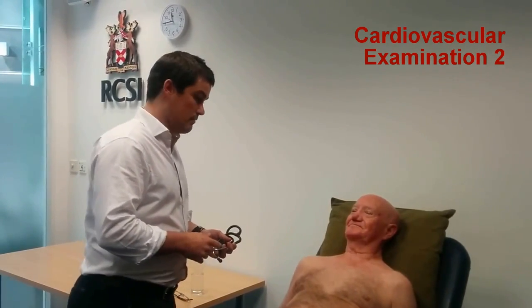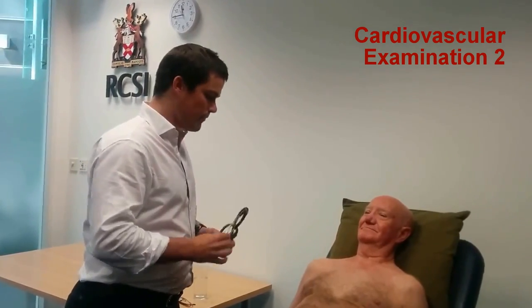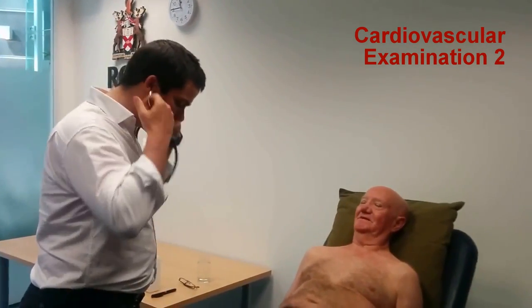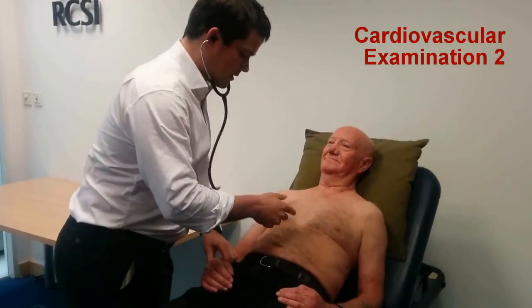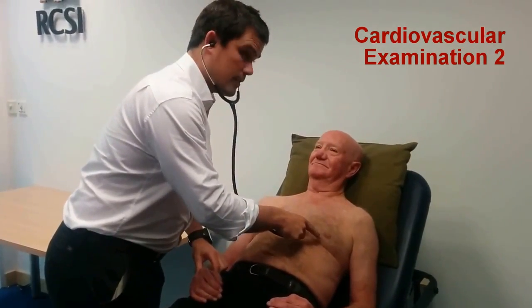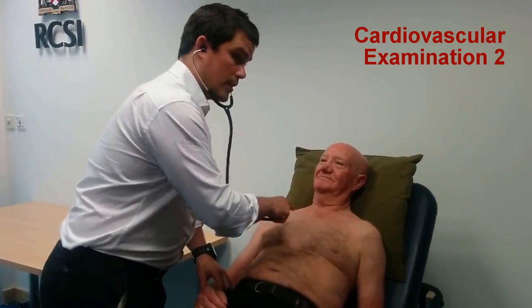I'm happy with the position of 45 degrees, and I'm happy with the exposure. I'll just check the radial pulse as I listen to the heart. I'm going to listen to the four cardiac areas: the mitral, tricuspid, pulmonary, and the aortic.